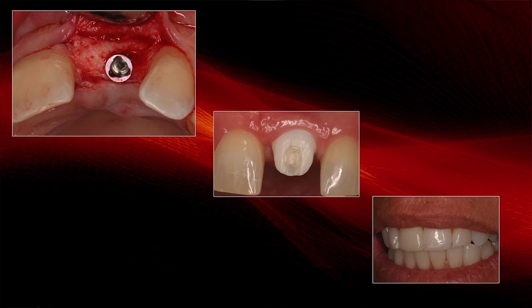And we have access, and we can see we keep the implant more to the palatal bone, which we discussed is more dense and away from the facial bone. Place a healing abutment. Since we have good primary stability, because the anterior bone between premolar and premolar is generally type 2 bone, we place a healing abutment.